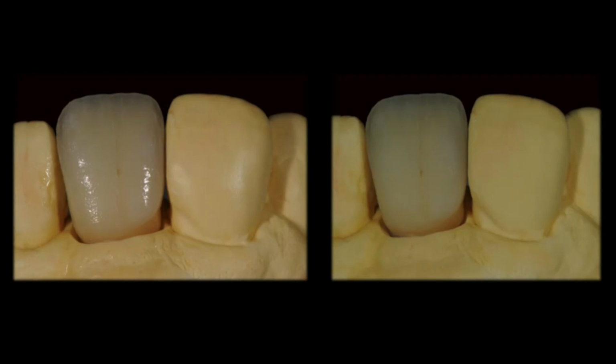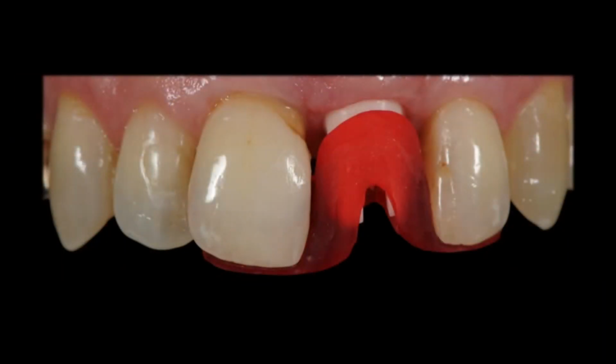We controlled the first bake, sorry, not the first base, the first bake. We controlled all the internal color effects. They were stained and fixed. Then we took a picture with the cross-polarizing filter to control and to compare if the effects are too strong or if they are good. They were good, and then the try-in procedure came.